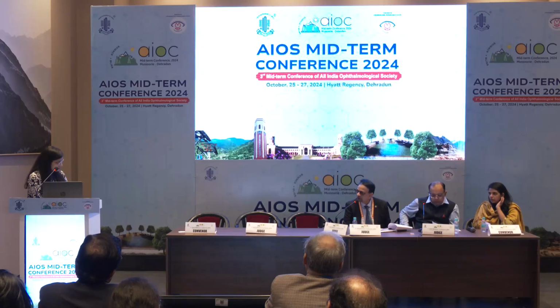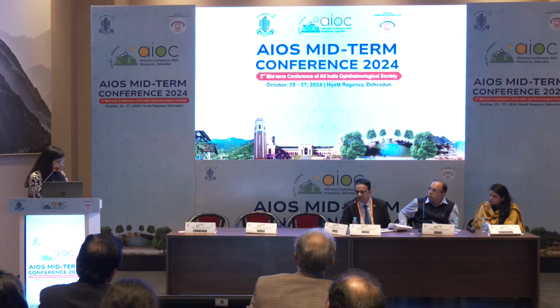Sometimes I do a pupilloplasty as well. Yes, sir. So to make sure the pupil does not dilate and cause a pupillary capture. Because once a pupillary capture occurs, the lens can start tilting and it can produce astigmatism as well.